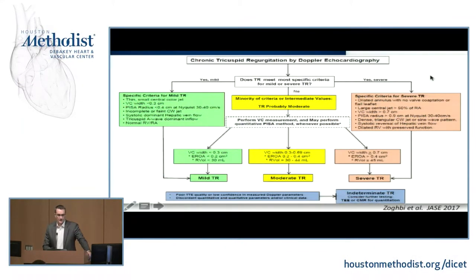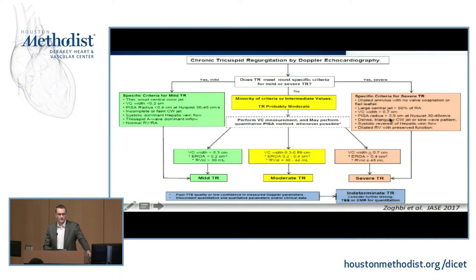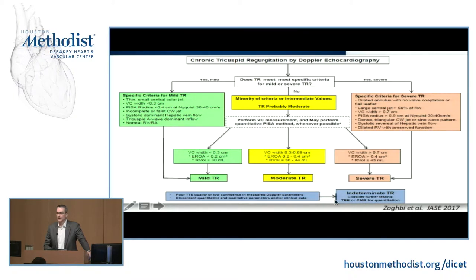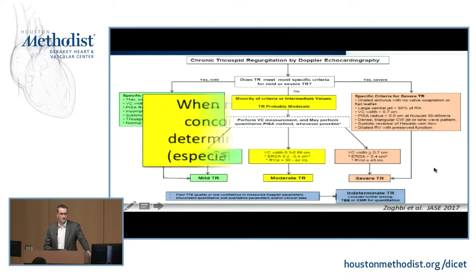Nonetheless, straight from the guidelines: if there's a bunch of mild features such as a thin vena contracta and a small central color jet with A-dominant flows, that's probably mild. On the other hand, if features collect suggesting severe — both color and CW features — it's severe. In the middle when it's indeterminate or moderate, that's when quantitation adds value, though the quantitation is tough. When you're worried about quantitation and considering an intervention, that's where CMR comes in. When multiple parameters are concordant, TR grade can be determined with fairly high probability.